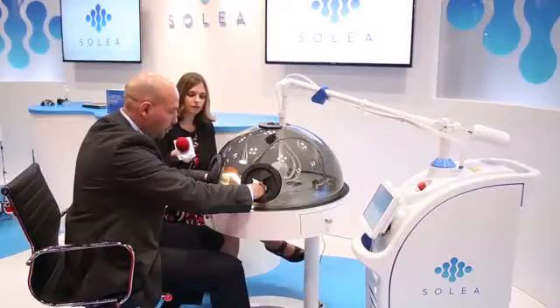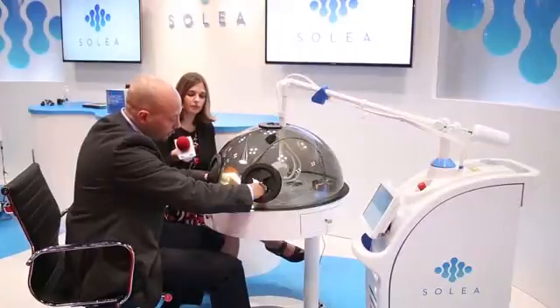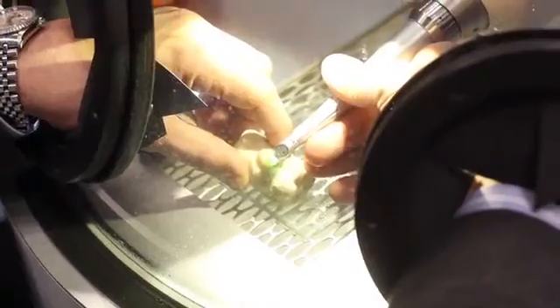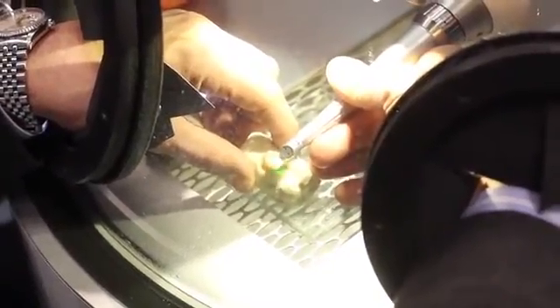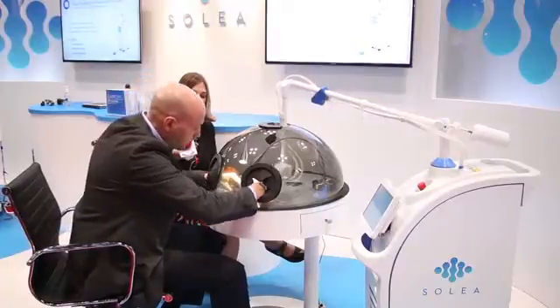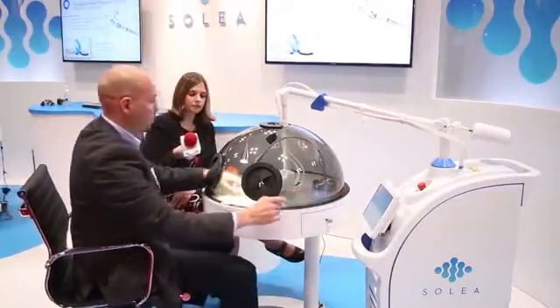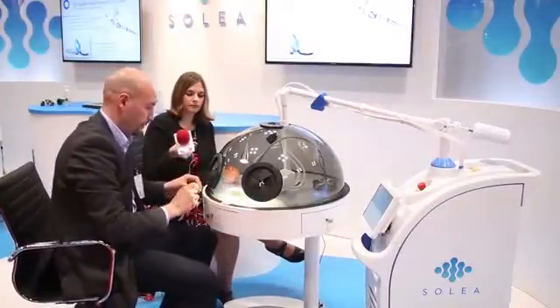So then we would make sure that we had nice smooth margins. We've excavated the decay, broken contact between the adjacent teeth. And there you are.